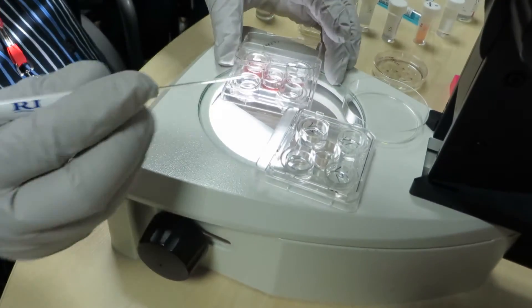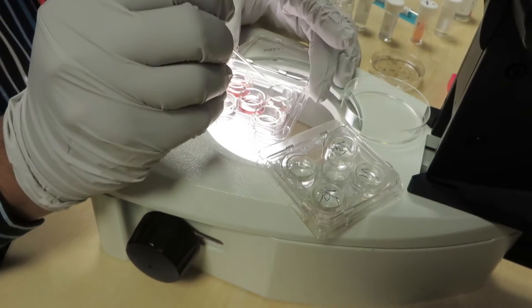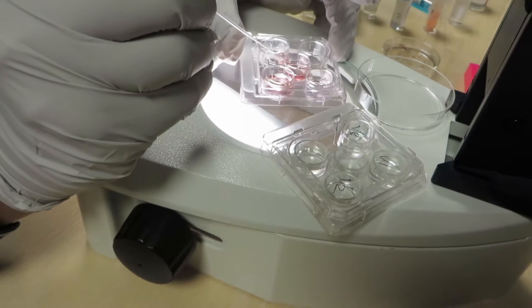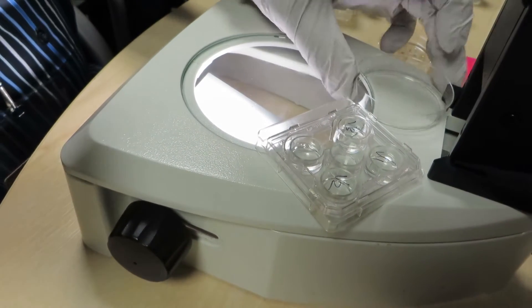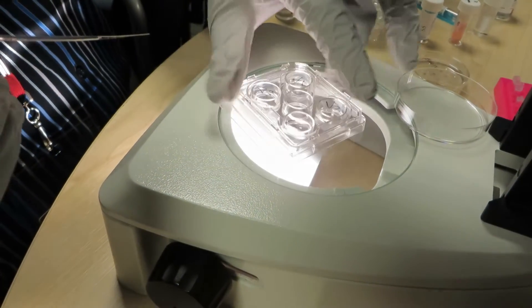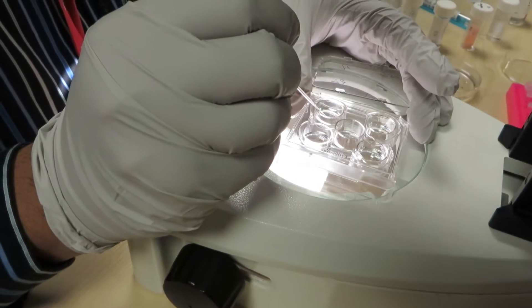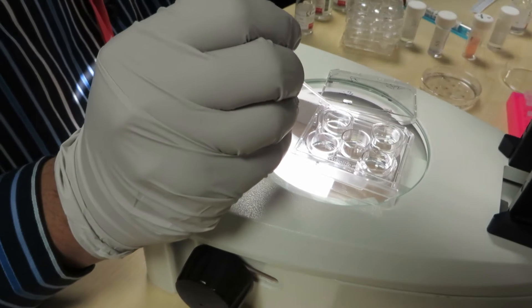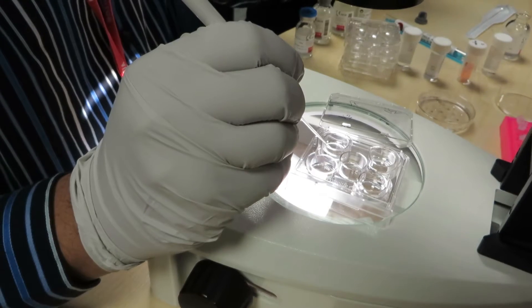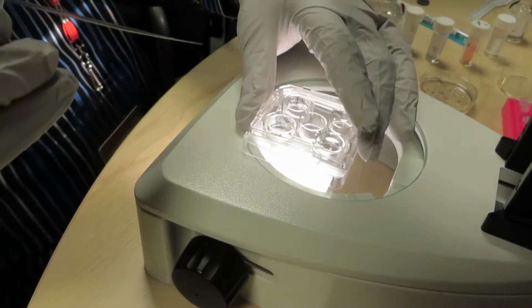Once we get the blastocysts, they are ready to be vitrified. The first drop, V1, is just a wash — you wash the embryo, and you do this whole process on a warm plate, because the dish has been warmed at 37 degrees for one hour before use. No need for gas, just warming. After washing in V1, put the embryo in solution V2 with minimal carryover, for two minutes at 37 degrees.